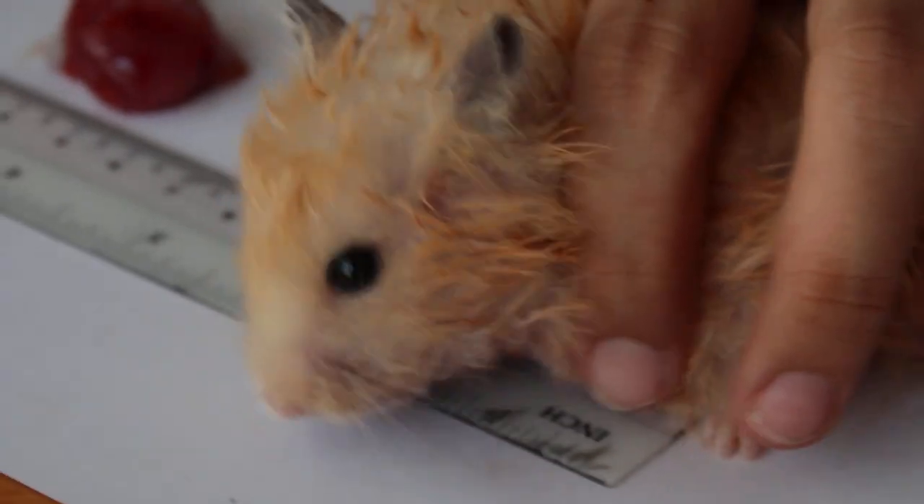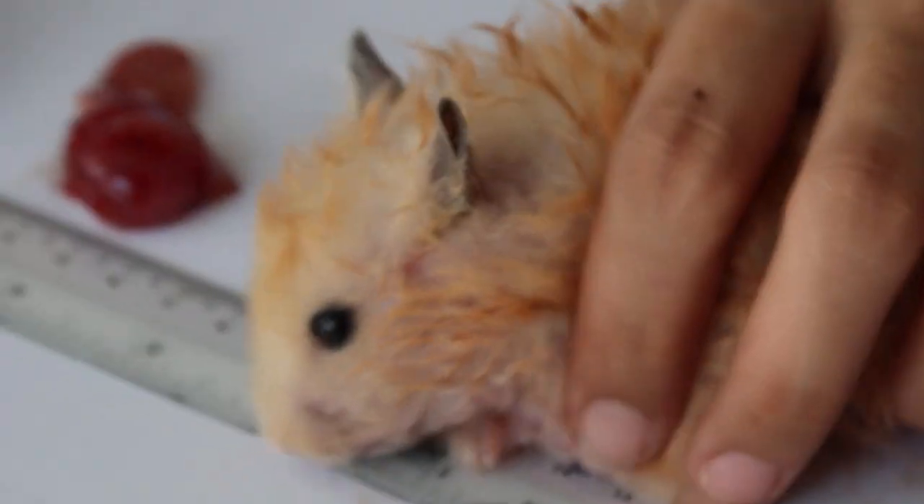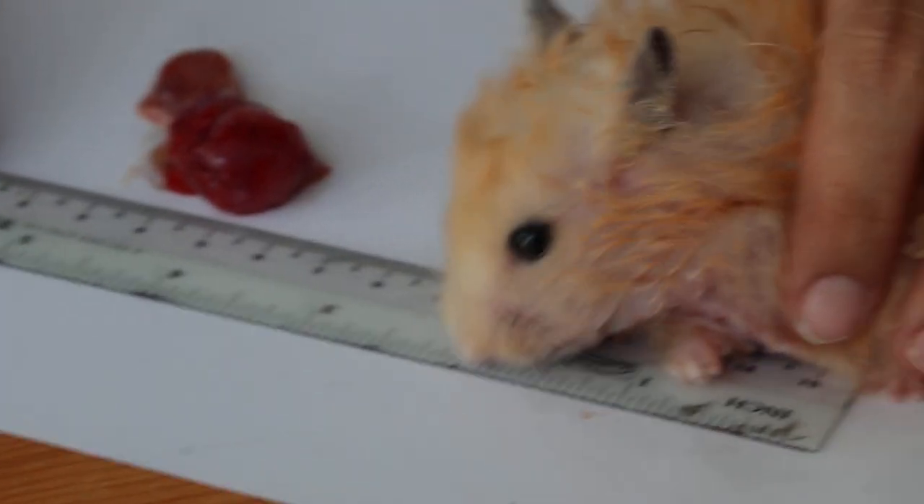This is about 20 minutes only. After the end of surgery, it's quite good. It's awake. There's a little anesthesia. No need for gas.